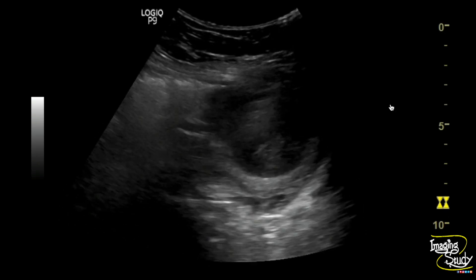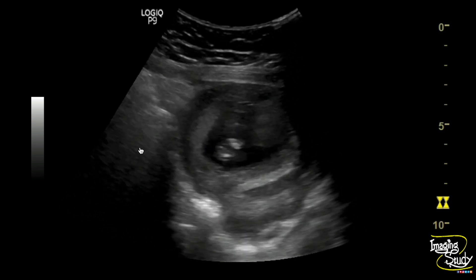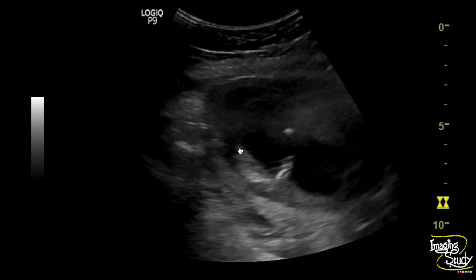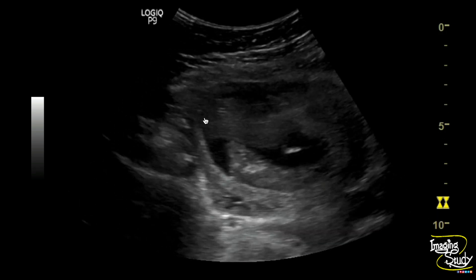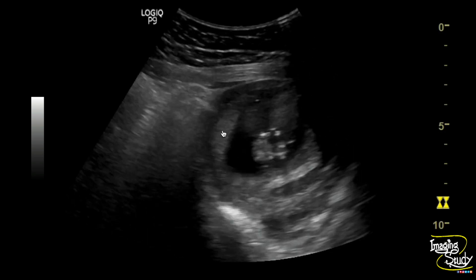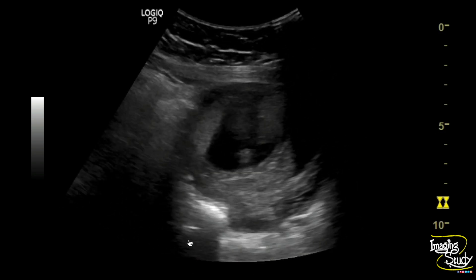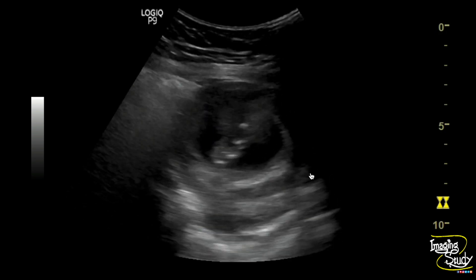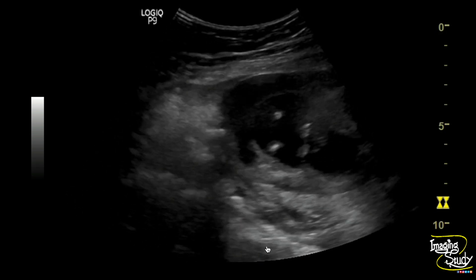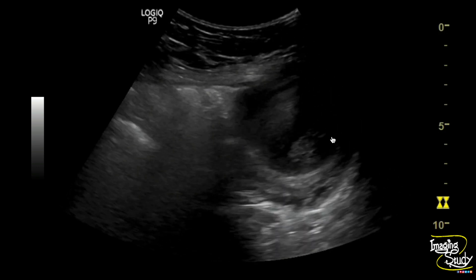Now let's see — this is the gestational sac. So what is this other area? This area is the chorionic collection extending between the uterine wall and the chorionic membrane, indicating retroplacental hemorrhage. This is a chronic hemorrhage appearing anechoic. It extends up to the placental margin. The fetus is alive and moving. Overall, this crescent-shaped area is the subchorionic hematoma.